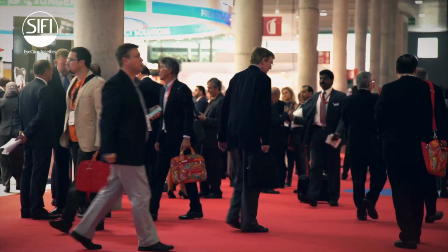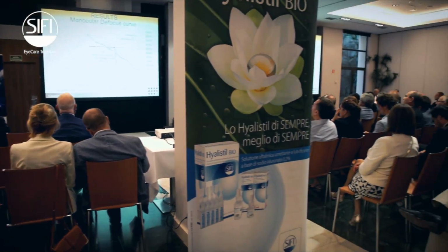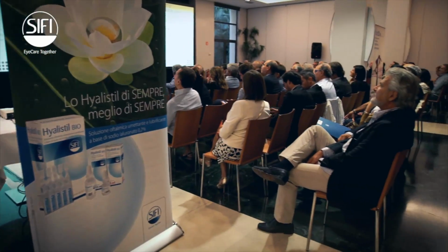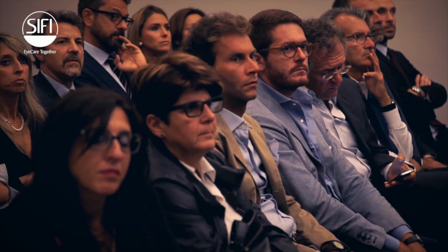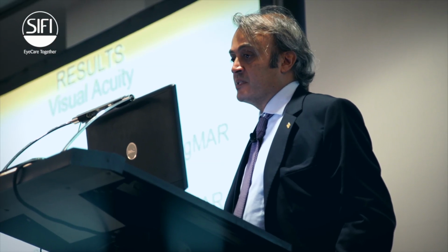Patients receiving this kind of IOL need to be perfectly emmetropic after surgery. This means that we need to rely on the most accurate measurements for axial length, like optical biometry or immersion biometry. We can reduce the percentage of eyes with a refractive surprise higher than half a diopter. These patients are easily not perfectly satisfied after surgery. So I think that the preoperative diagnostic is one of the most important things to take care of when we see our patients.